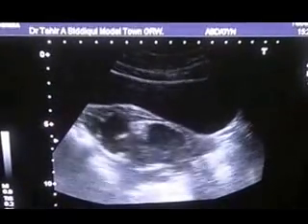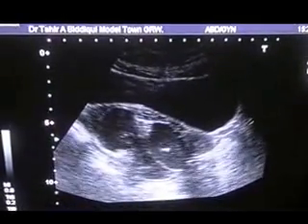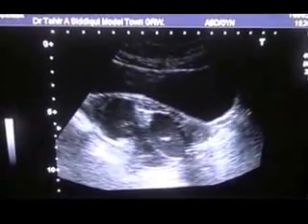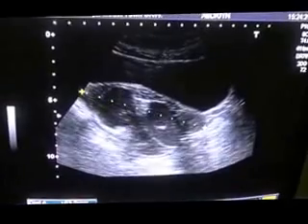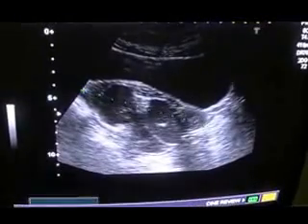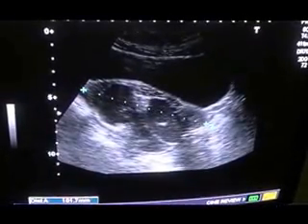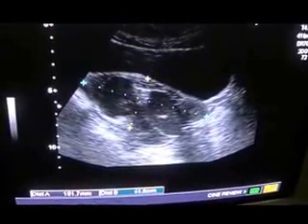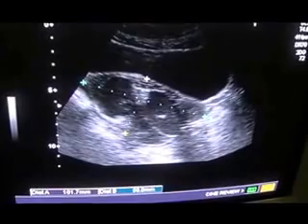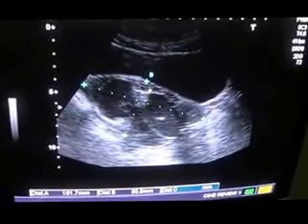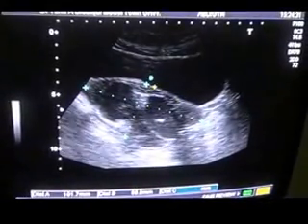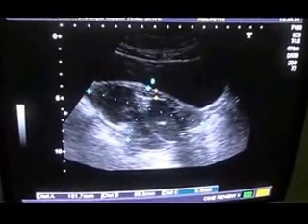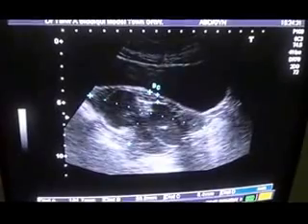In the longitudinal section, this tubular cystic structure is full of debris and it measures approximately 10.10 centimeters in length and 5 centimeters in anterior-posterior diameter. This is the wall — you can see the thickness of the wall. The wall measures 6.4 millimeters.